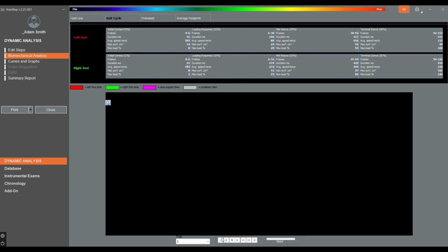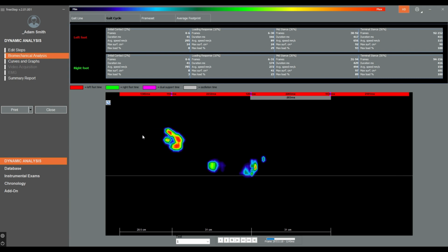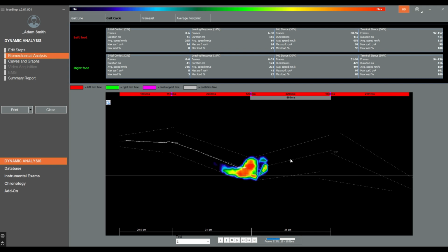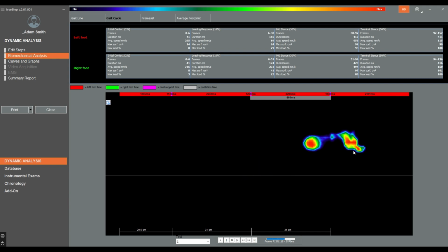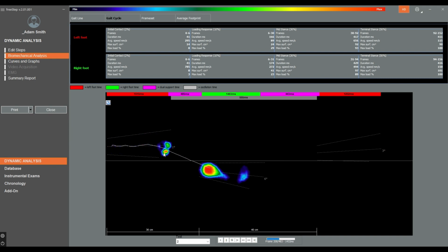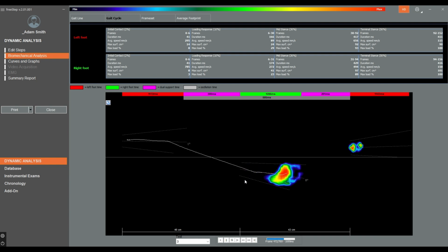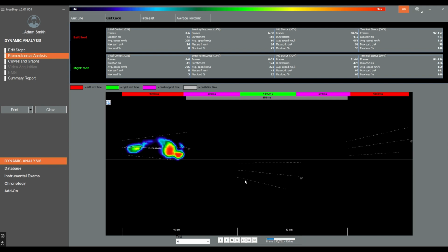Looking at the gait cycle, it's showing you the line of best fit here, and again, weird distribution as he pushes off. And so again, that tells me there's probably some hallux rigidus. If you had a shockwave machine, I would do some shockwave on his right heel around the plantar fascia insertion, and then through the hallux, or gentle mobilization adjustments, etc., etc.